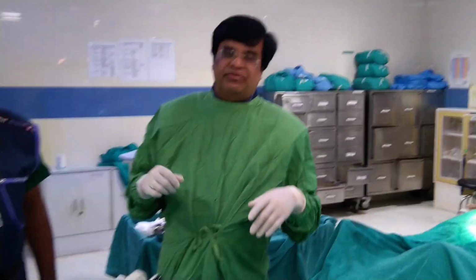Thank you very much for watching this video. Good pre-dilatation and good utilization of intracoronary Nicorandil, all these things help the patient's recovery.